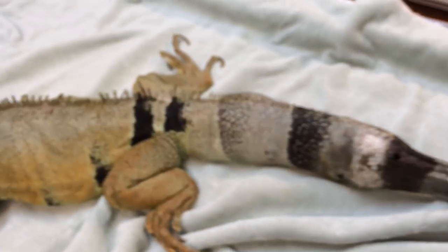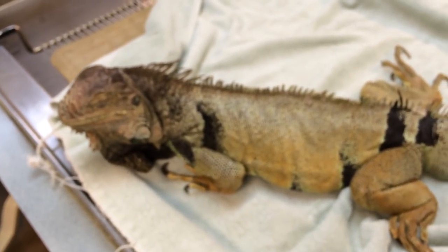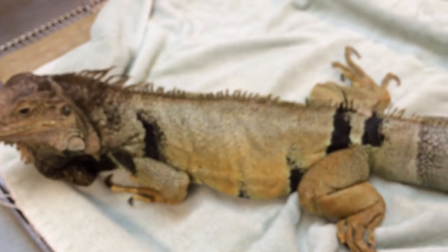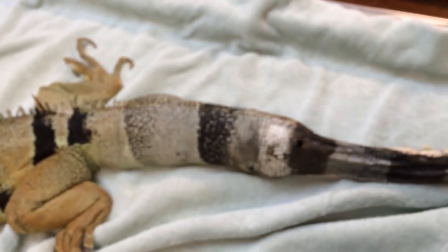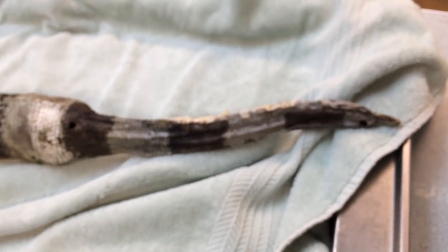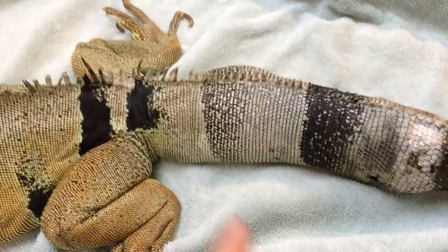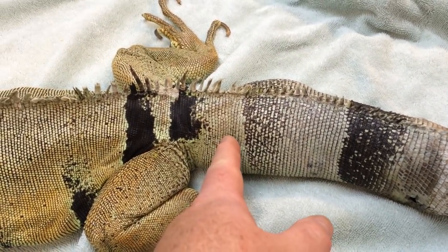So my guess is, I'm actually gonna venture a guess. As many reptiles I've seen in this area, and as many maggot cases and pus cases as you guys have seen with tortoises and stuff, I think this is one of those strange species where one of those maggots has somehow gotten into this guy. And so anyway, to save this guy's life, we're probably going to have to amputate this lizard's tail about right here, which leaves us not much to work with.